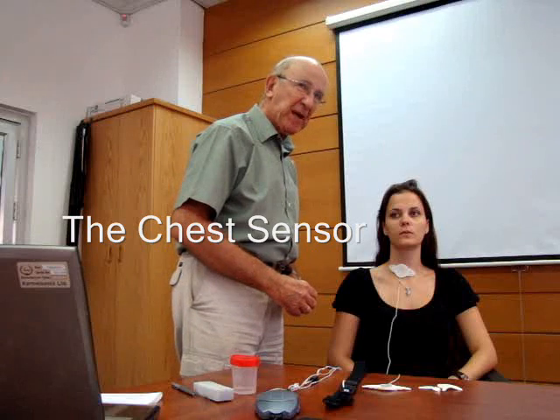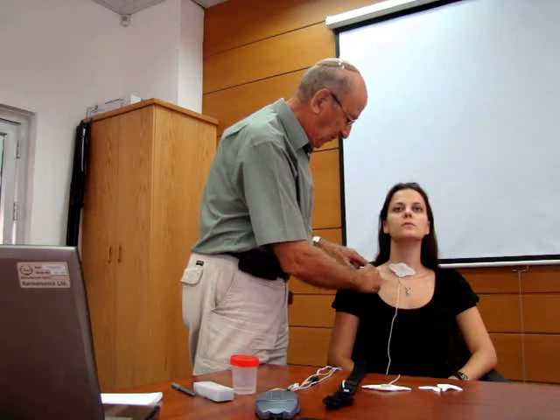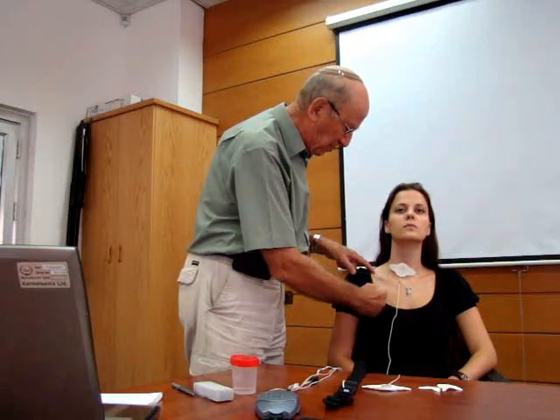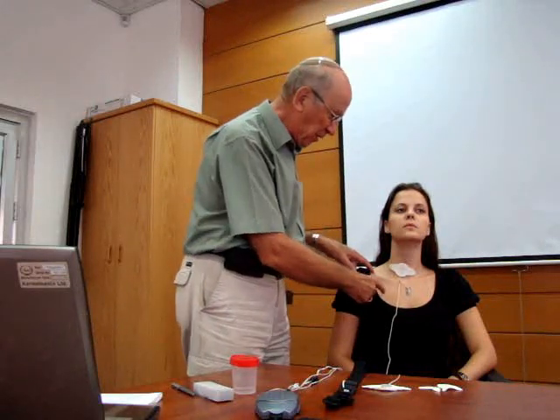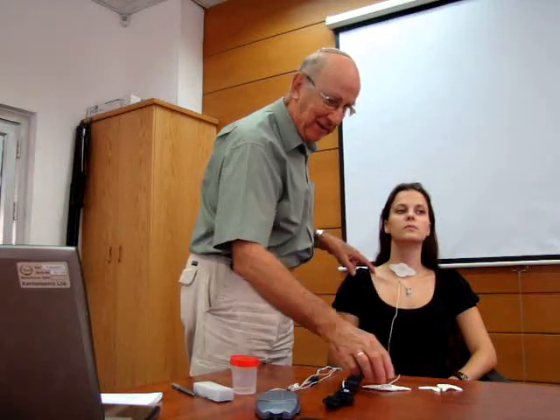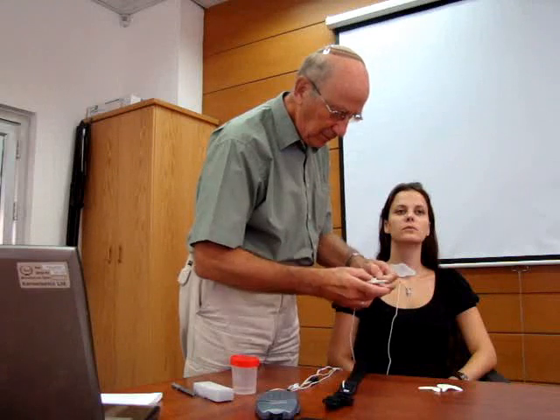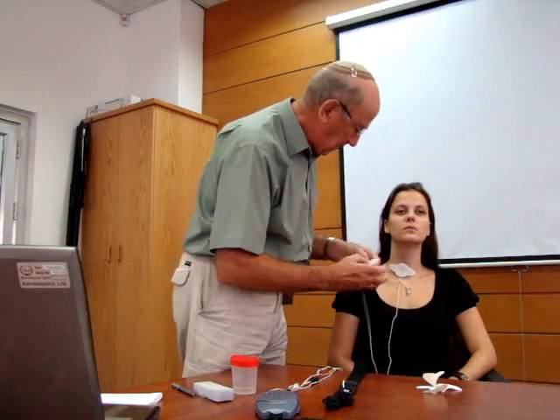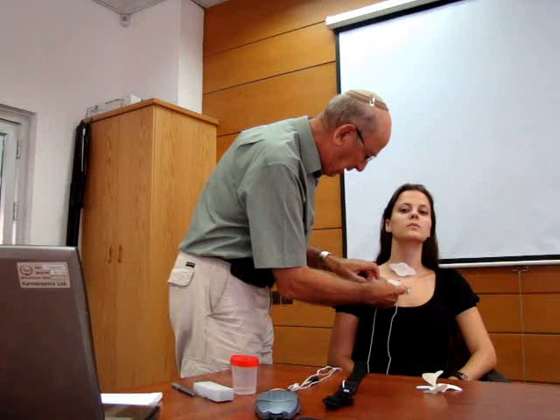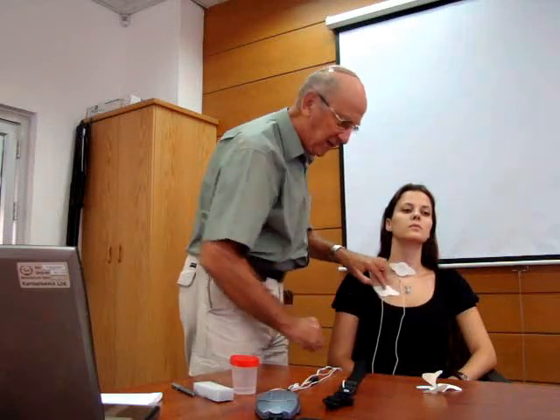The chest sensor is placed on the right side in the second intercostal space. Here we have identified the clavicle; you feel the first rib here, so the second intercostal space is here, and we put it in the mid-clavicular line. If we're dealing with a subject who has a lot of hair on the chest, we recommend shaving the chest first before cleaning it and placing the sensor. I'll now remove the backing from the chest sensor, check my landmarks at the second intercostal space, and apply tension to the two wings to place the sensor on the chest.